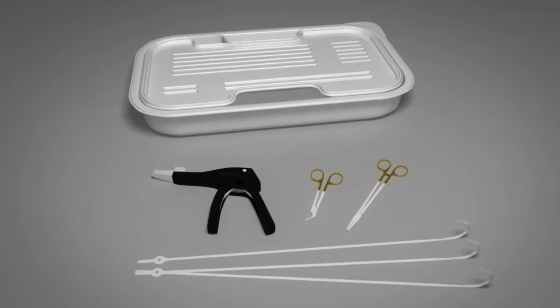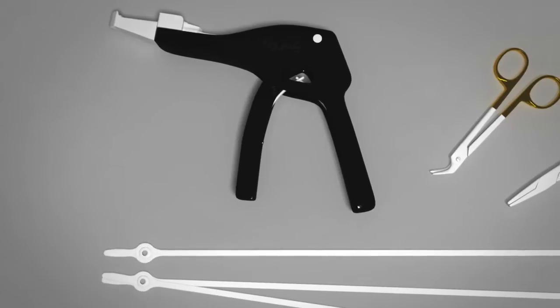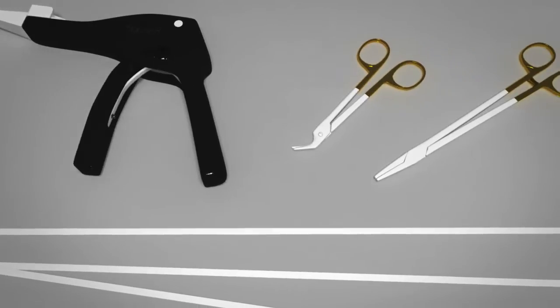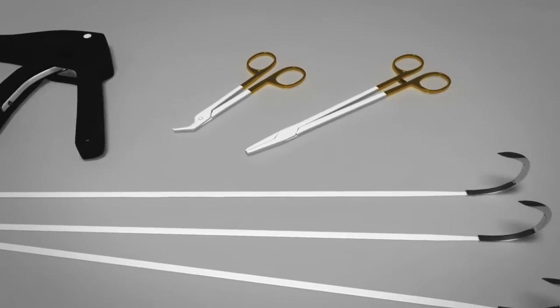The Figure 8 Sternal Closure System is revolutionary, simple, and provides a stronger and more stable construct that results in less cut-through than traditional steel wire cerclage.